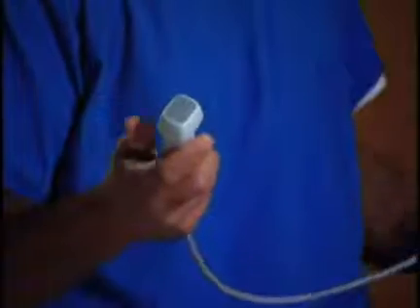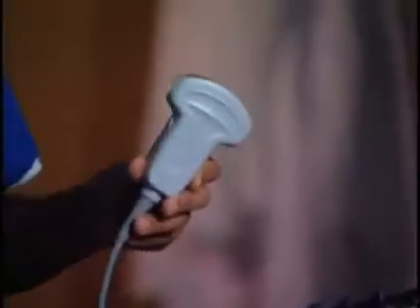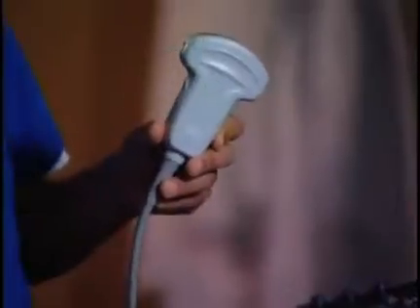The other transducer that you may also have is a curvilinear transducer. This is an excellent transducer, though you'll sometimes have problems with rib shadows. So you can use either one, but for today's demonstration, I'm going to take you through a phased array.